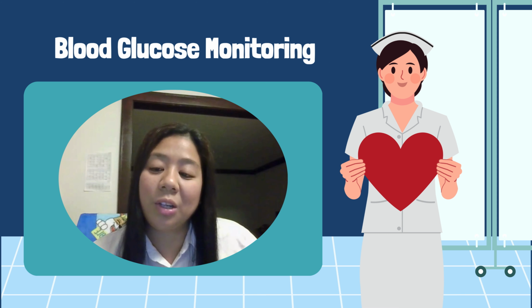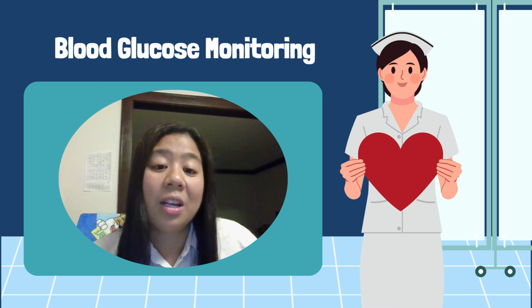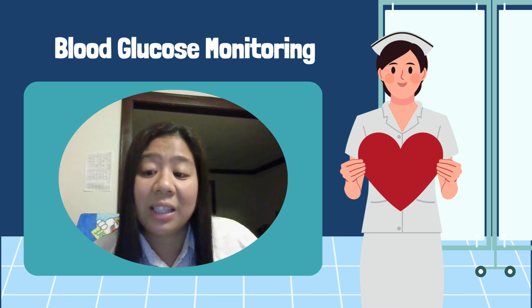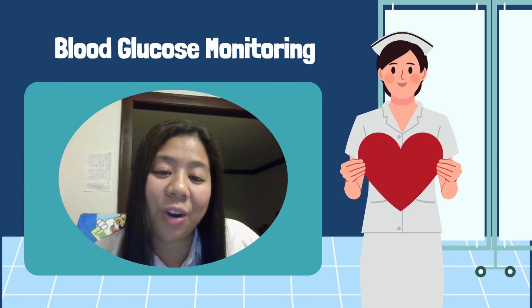Blood glucose monitoring helps identify patterns in fluctuation of blood glucose levels that occur in response to diet, exercise, medication, and pathological processes associated with glucose fluctuation, such as diabetes mellitus. Unusually high or low blood glucose can potentially lead to life-threatening conditions, both acutely and chronically.